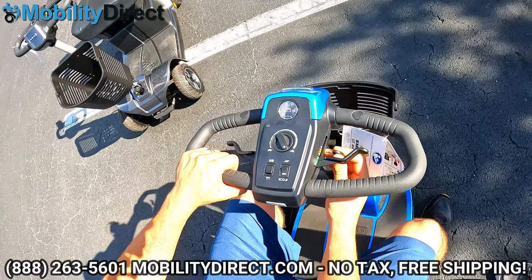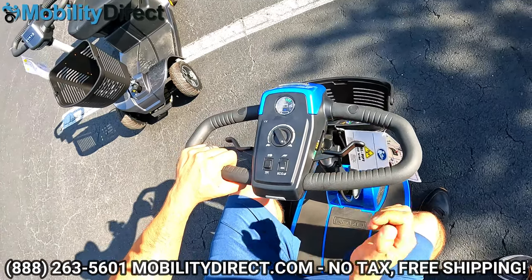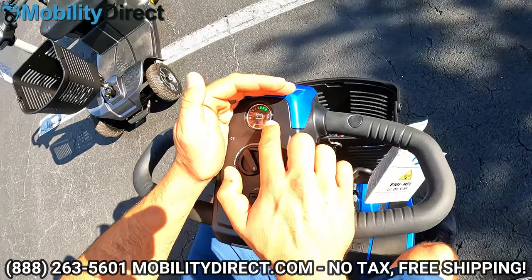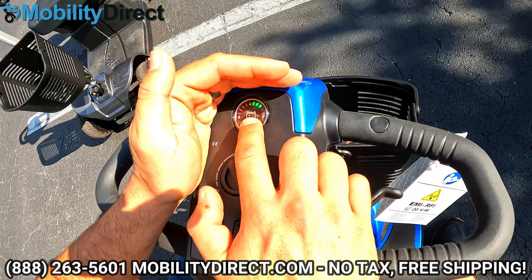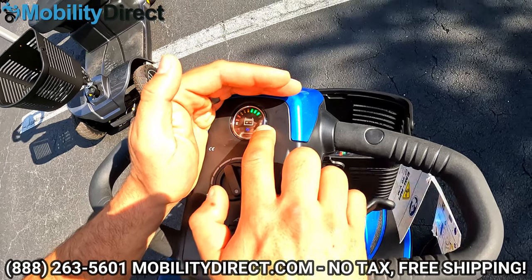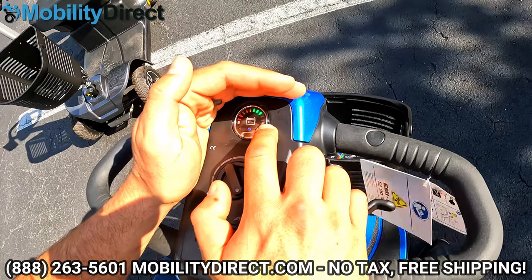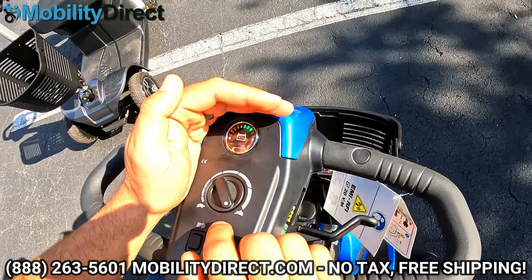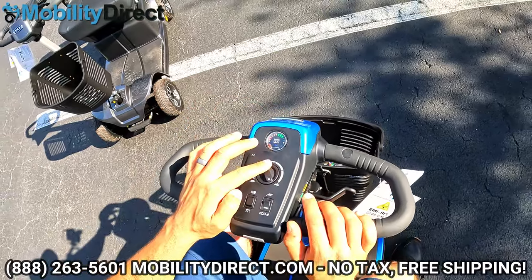Put the key in the ignition and turn it on — your battery meter lights up. The battery meter has several lights: five green lights, three amber-yellow lights, and two red. Right now the battery is discharged a little, which is why the first two green lights are off. Typically, when it gets down to the yellow is when I start to charge. When you first get your unit, make sure you charge it overnight.